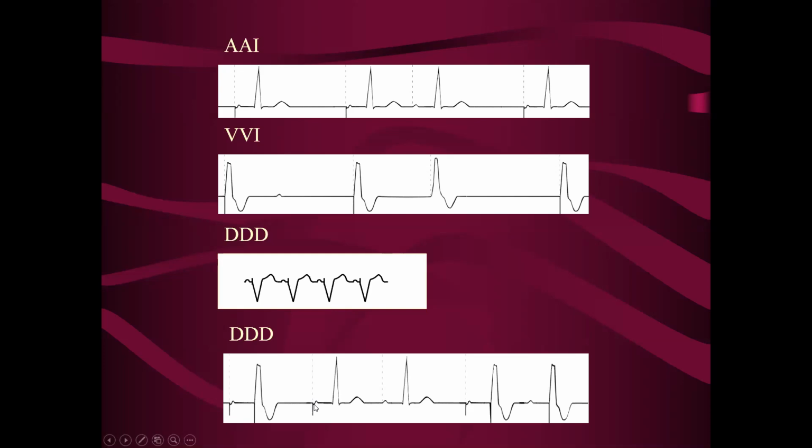You can also be just pacing in the atrium, and the patient may be intermittently conducting to the ventricle. And this is where, remember, we talked about it waits for the AV delay or the PR interval to time out. And if there's no intrinsic conduction at the end of that AV delay, it's going to deliver the ventricular pacing impulse. So here, while it's waiting for the AV delay to time out, the patient actually conducted, and when it conducts in the ventricle, it inhibits the ventricular pacing.